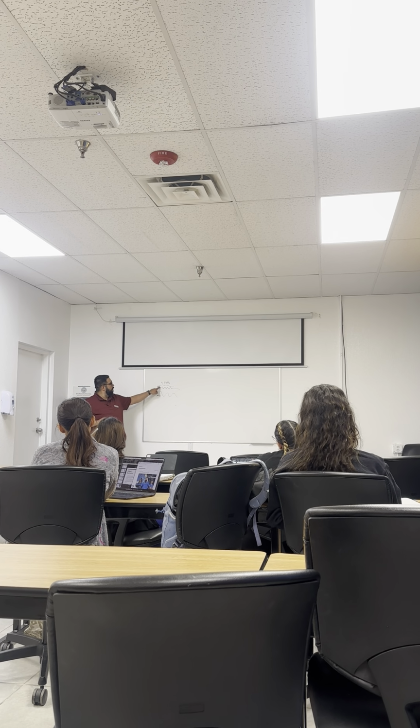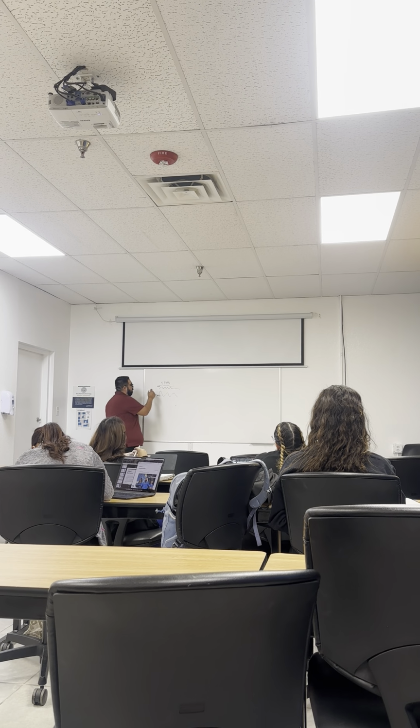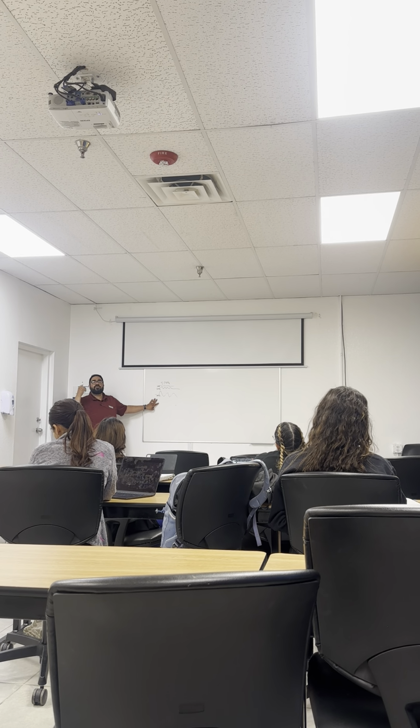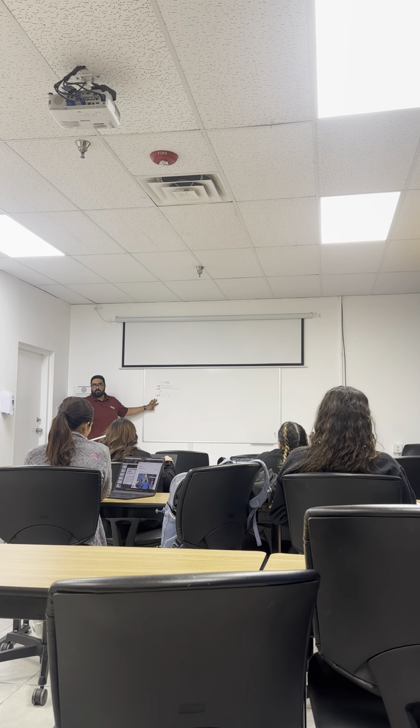Do we want this 2 megahertz frequency? No, right, because what is noise? It's low level echoes, so this is just going to create more noise. This is our fundamental frequency, this 5 megahertz right here, which is what we want. Do we want the 7 megahertz? It's more intense, right? The more intense, the brighter the echoes, so possibly the better the image, depending on what we're scanning.